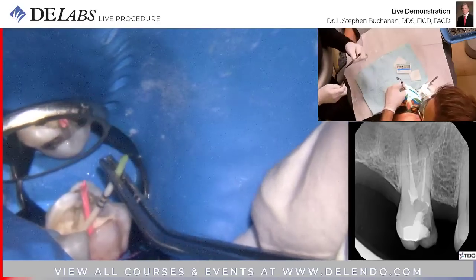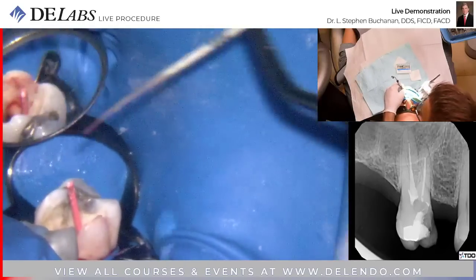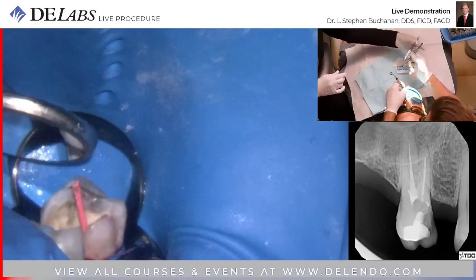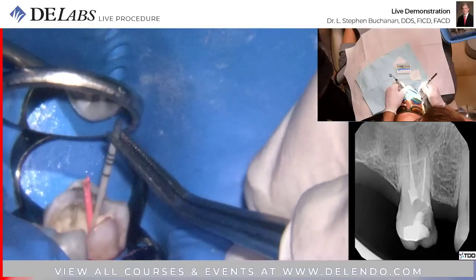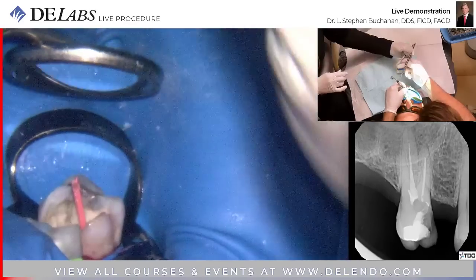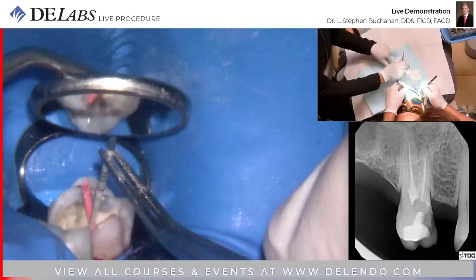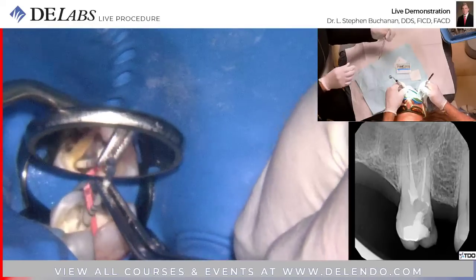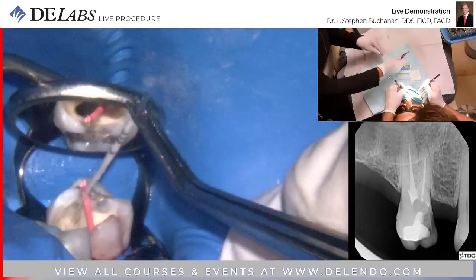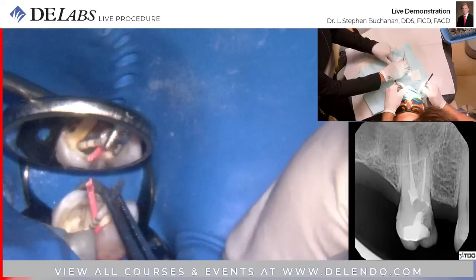Bowl. Let me have a bigger cone. Okay, sealer.